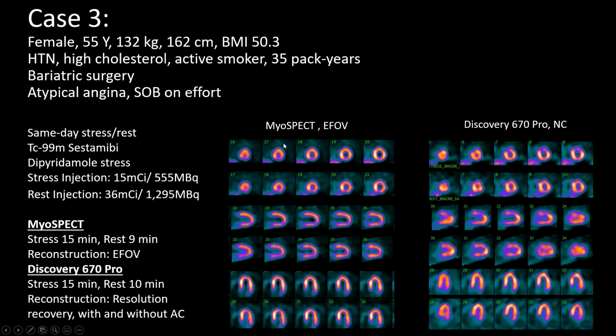In contrast, the MyoSpect images with the extended field of view option are characterized by high resolution, very good images with a small reversible perfusion deficit in the inferoapical region, suspected of a small amount of ischemia in the distal LAD territory.